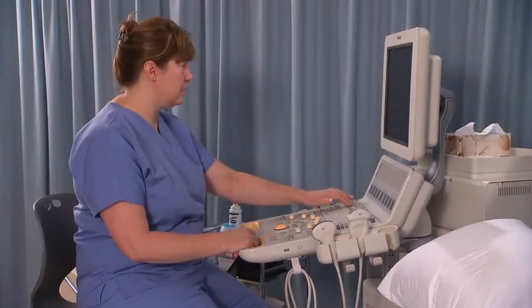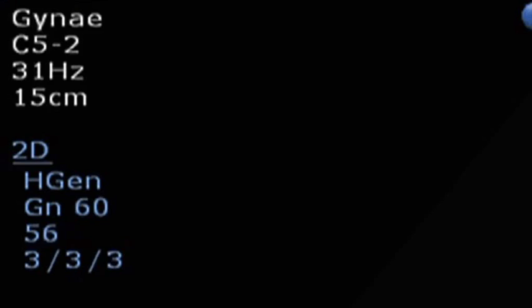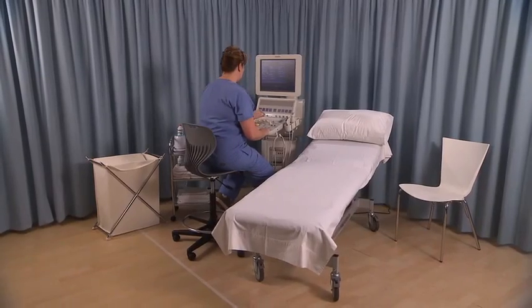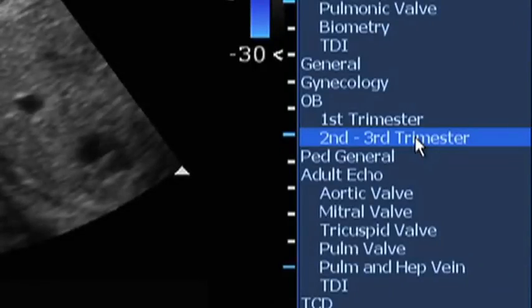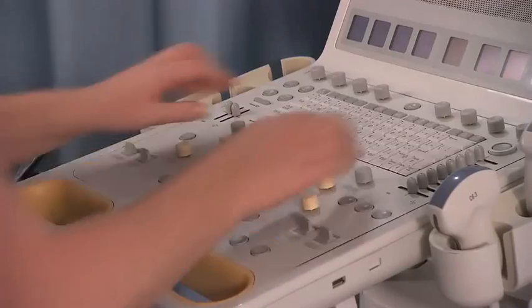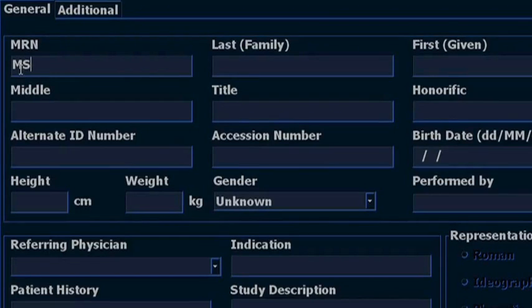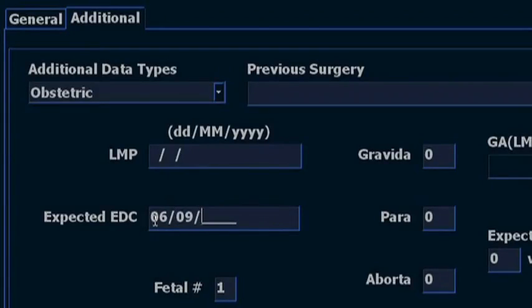Select the appropriate transducers for second and third trimester pregnancy examination. Select the appropriate preset for growth and high-risk pregnancy scanning. Enter the patient details and either the date of the patient's last normal menstrual period or the estimated date of delivery.